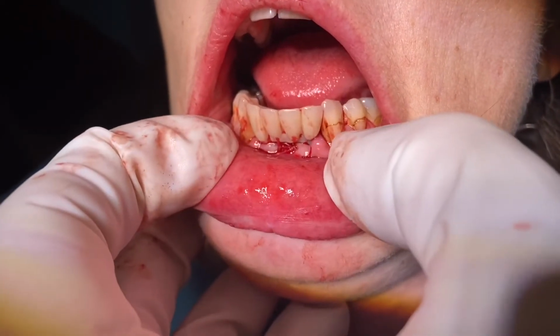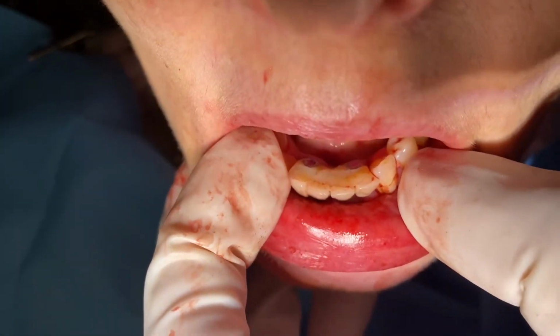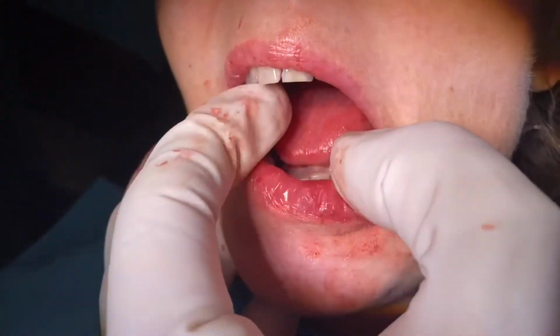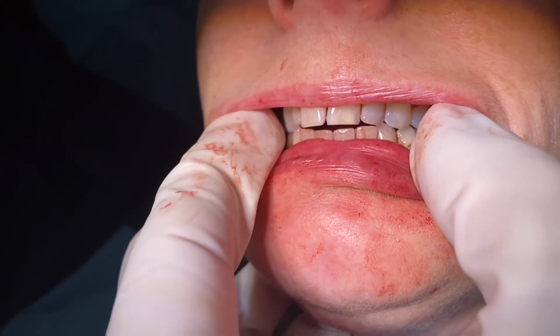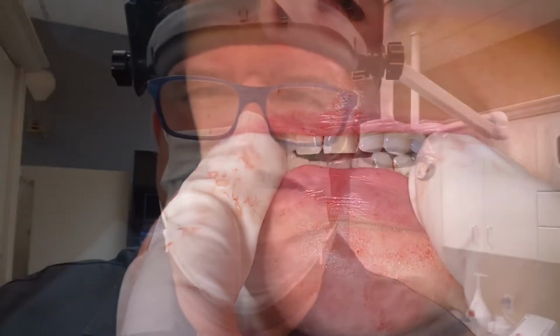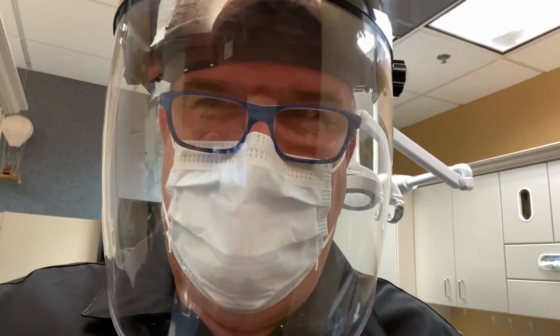We're not really waiting for the tissues to make their move. We're creating the tissues to be flat so that the floss will pull across there very easily, but we'll still have a nice seal with the soft tissue. Move forward, back. So I like this concept, and it makes it so that the patient doesn't have any occlusion on the bridge, so we don't want that during healing. So anyway, try this out.